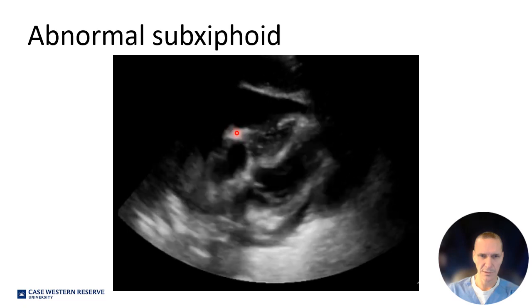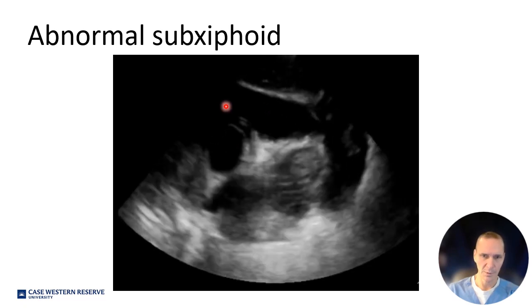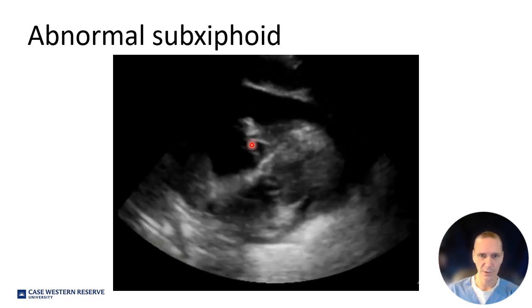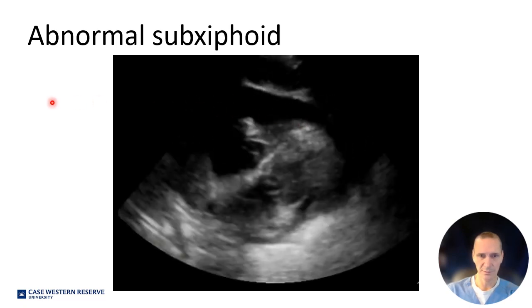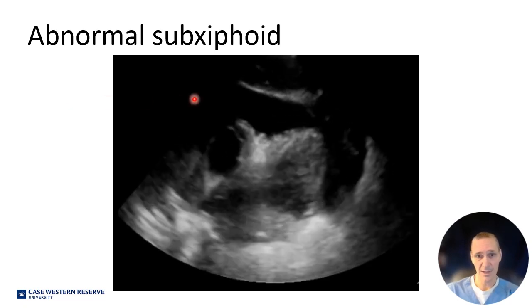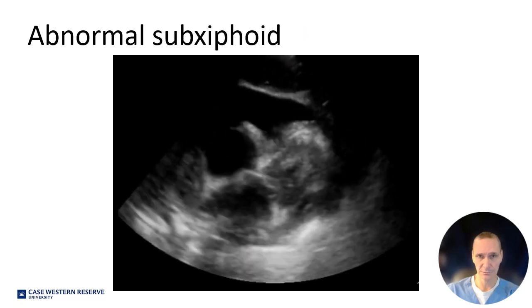It's kind of hard to see, but the RA also starts to collapse in a little bit. But what this is telling you as a clinician is this guy has no preload. This is an emergency, and this may warrant emergent thoracotomy. Somehow, somebody has got to get this fluid out.